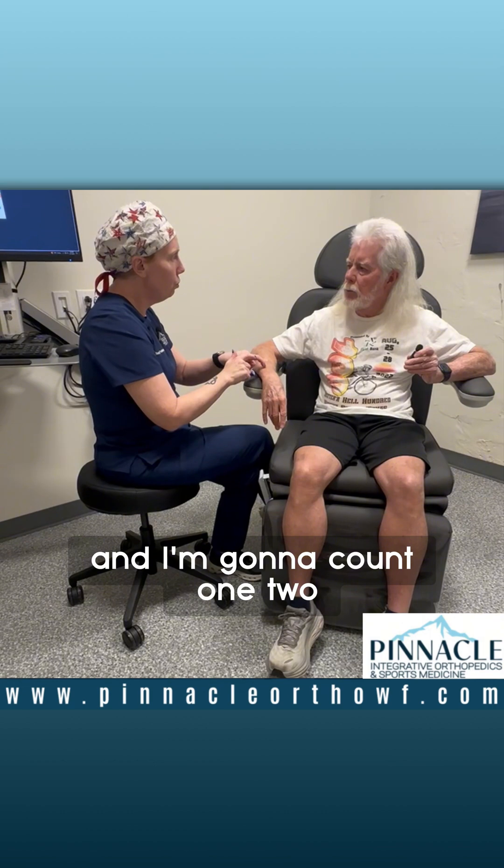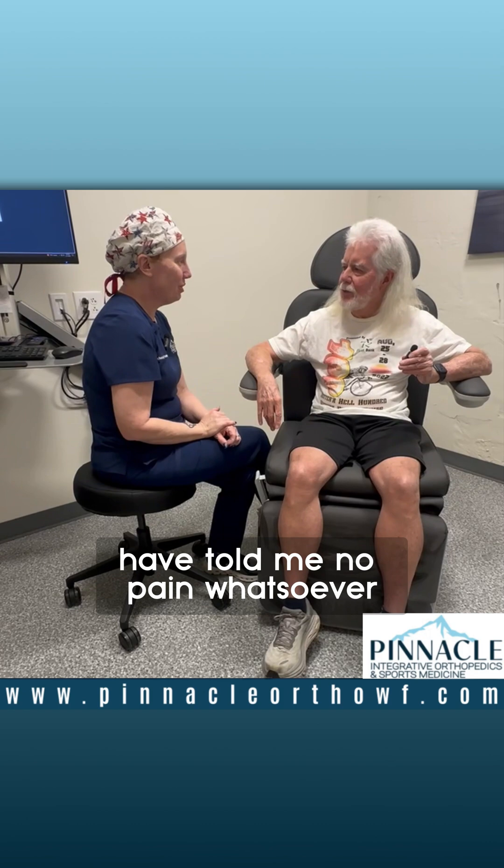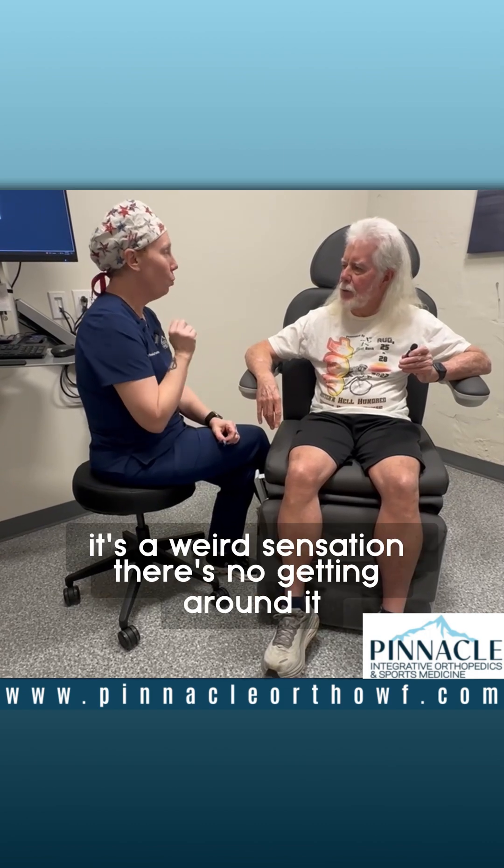And I'm going to count: one, two, three, tap. Might make you jump a little bit. 100% of my patients have told me no pain whatsoever. But you feel the vibration — it's a weird sensation.